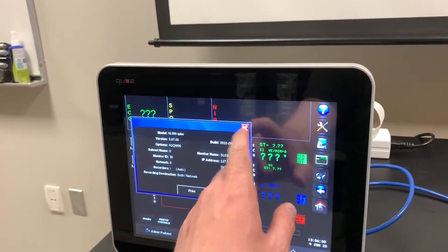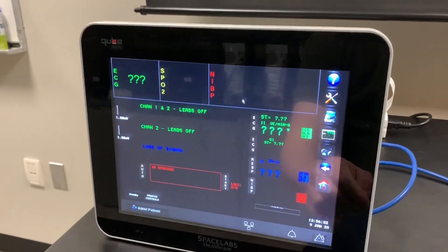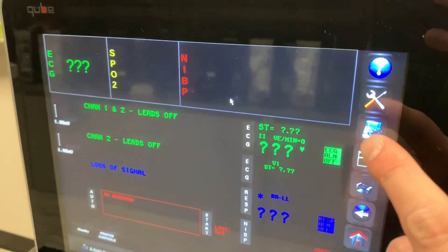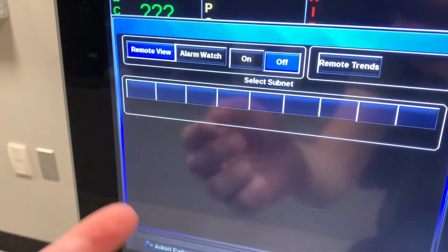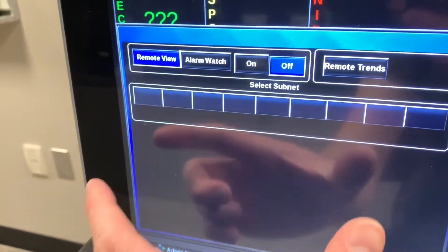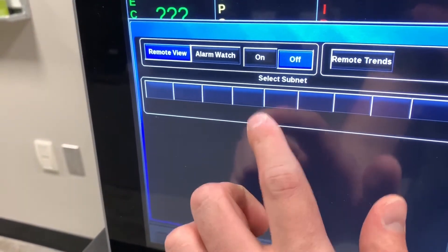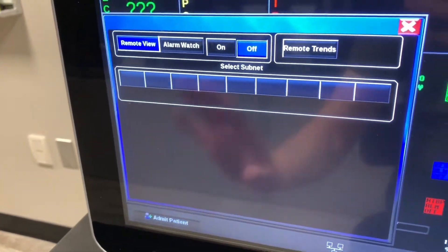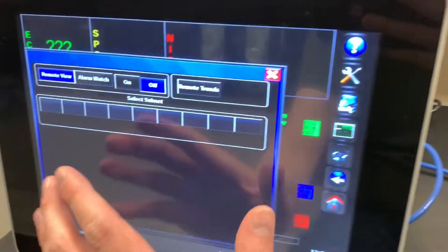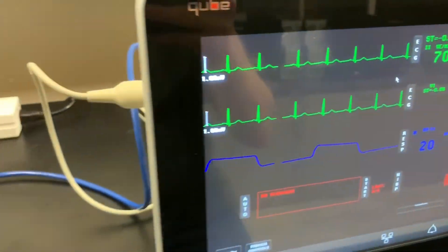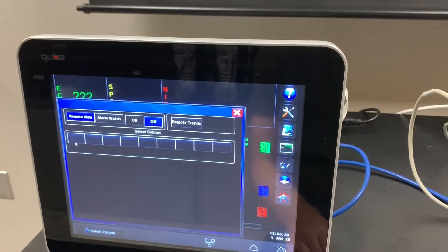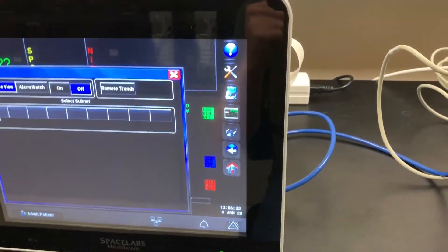Our end goal is we want to view the remote trends — this button here — and you can see there's nothing listed as available. It would have us select the subnet, which is actually different than the networking subnet, but we won't go into that. If this machine was able to be seen, it would show up here and we'd be able to see the remote trends from it. So what we need to do is give both of these machines an IP address that allows them to directly connect to each other.